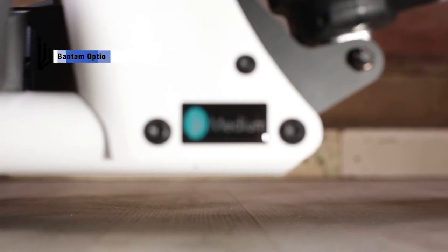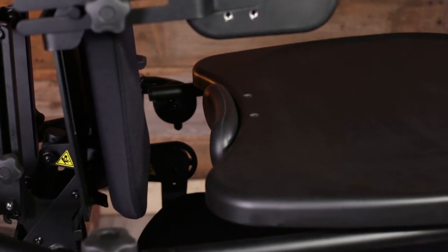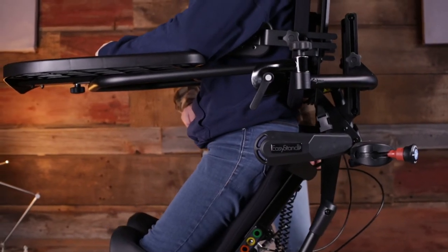The EasyStand exclusive Shadow Tray for the Bantam Medium gives users the comfort and customization needed to get the most out of their standing sessions. The Shadow Tray has a chest pad providing anterior support throughout the sit-to-stand transition.